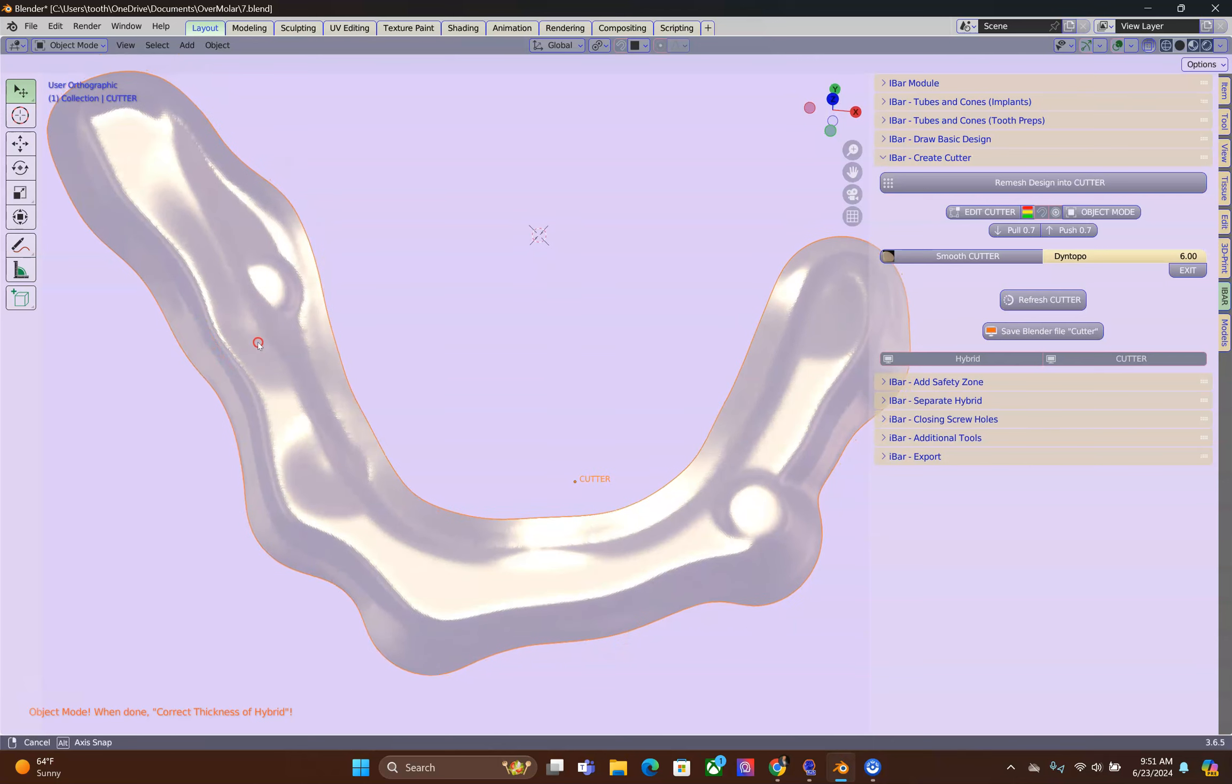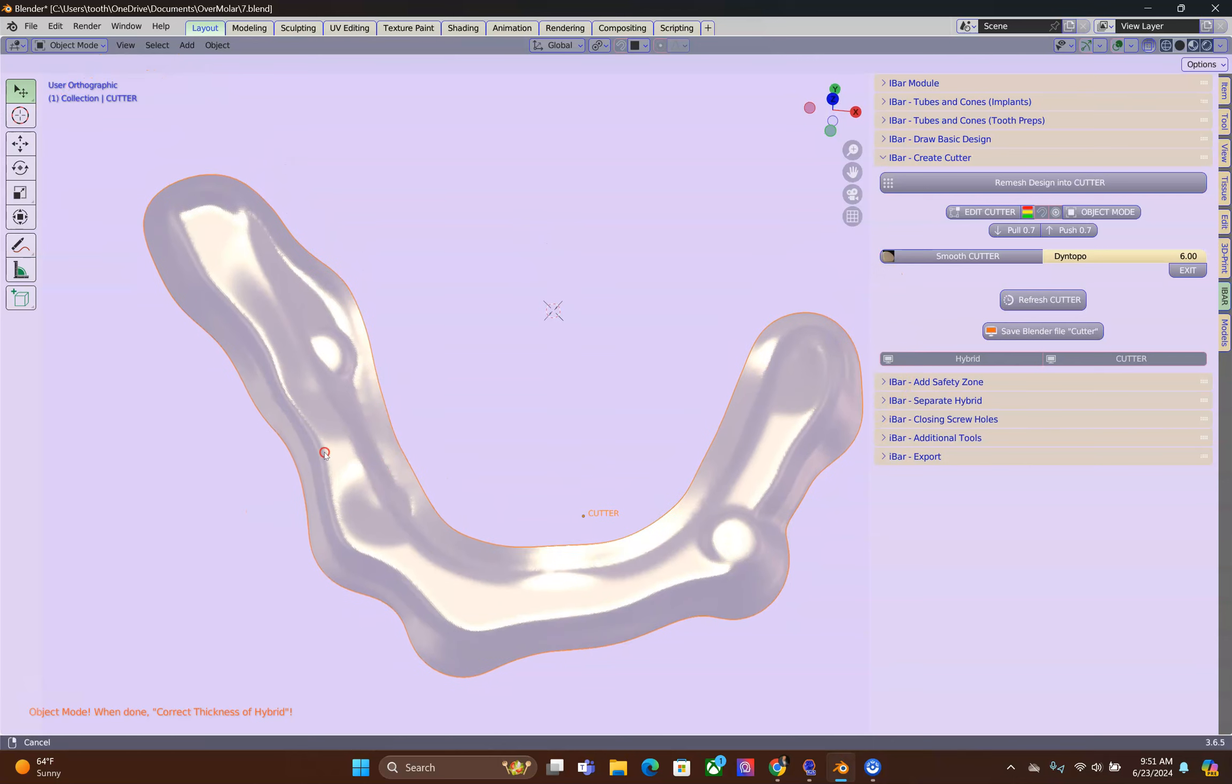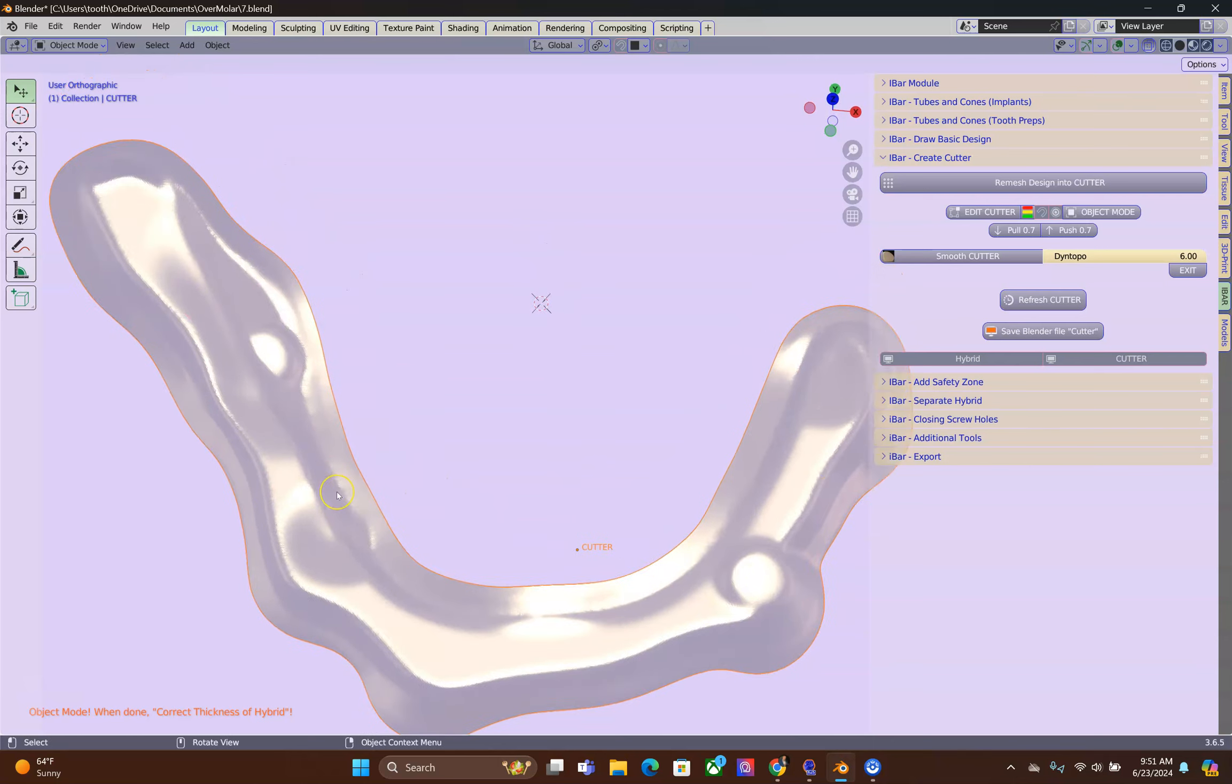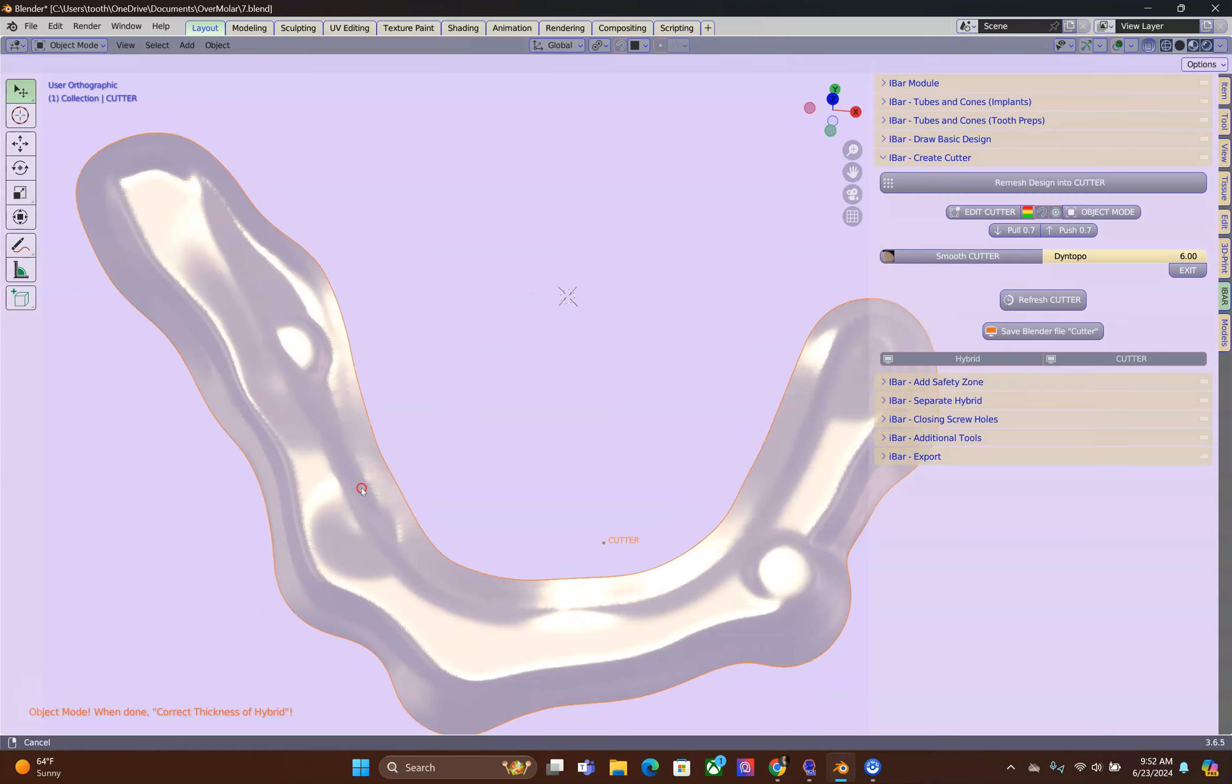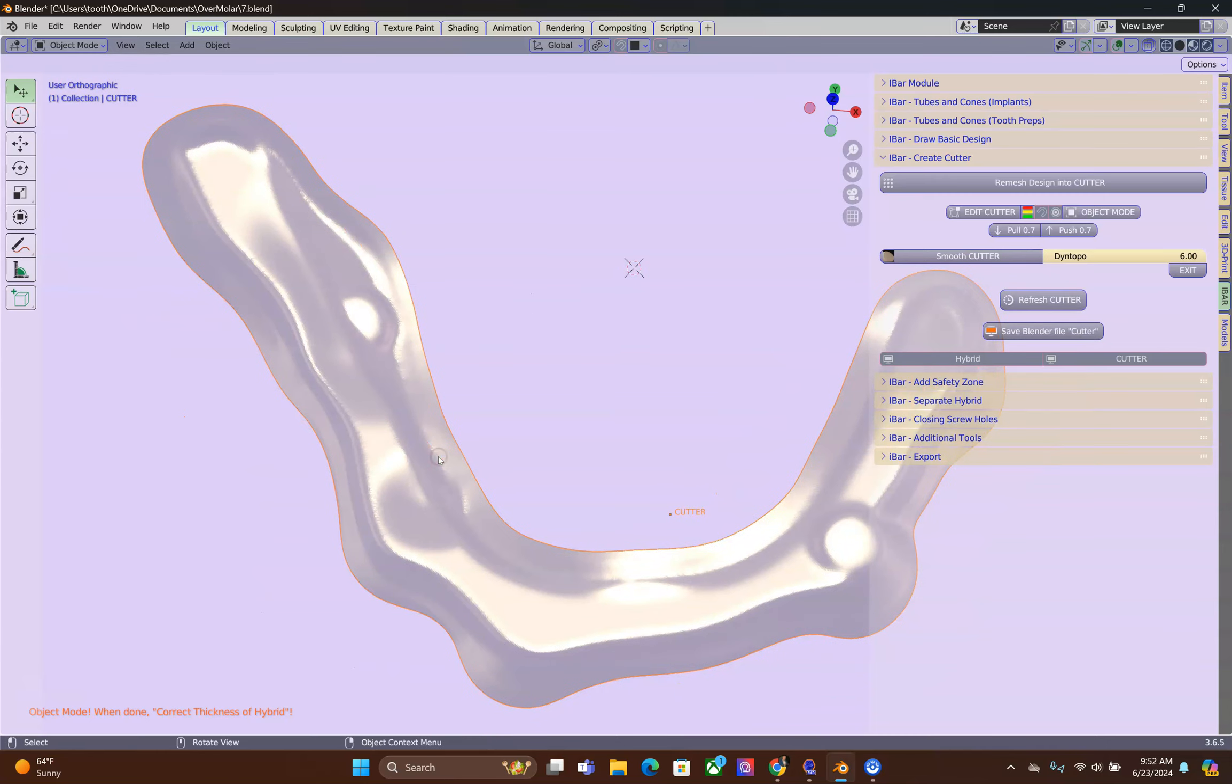So, in this case, there is no need to use a block out module. I don't see any undercuts.